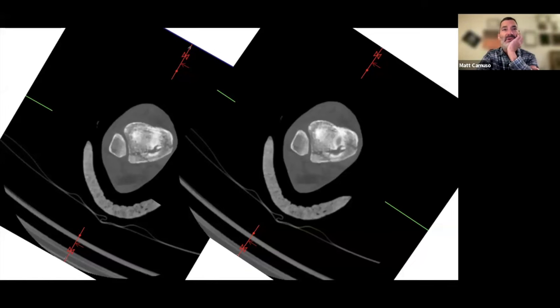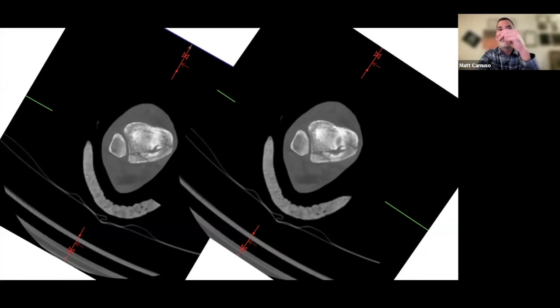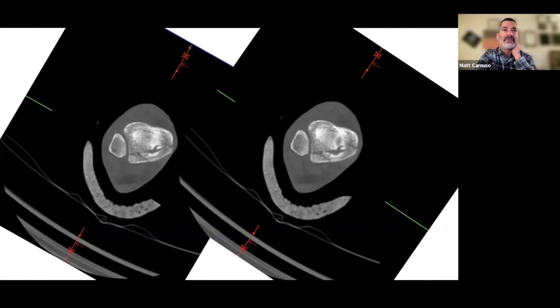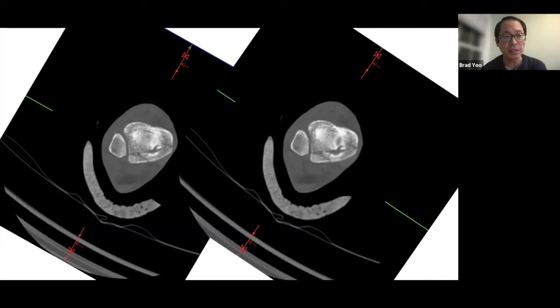Even 10 years ago, this set of X-rays might have been interpreted as just a posterolateral malleolus, with fixation only if the syndesmosis was unstable after lateral and medial fixation. CT enables full understanding of fracture morphology, planning of the surgical approach, reduction of articular impaction injuries when reducible, and removal of impaction fragments that would otherwise impede the posterior malleolus reduction.